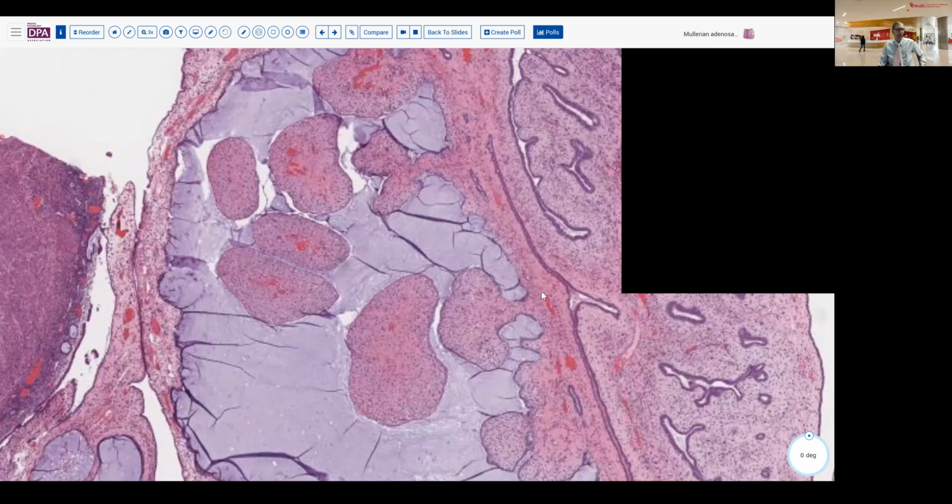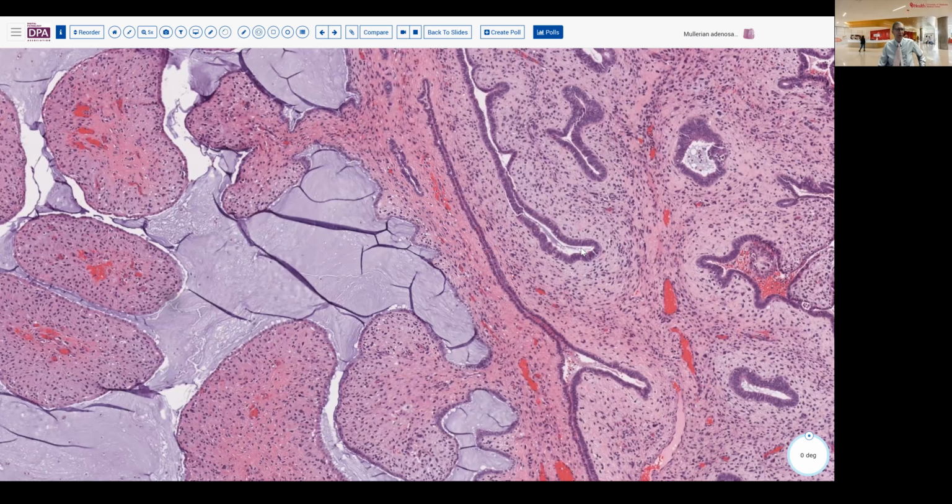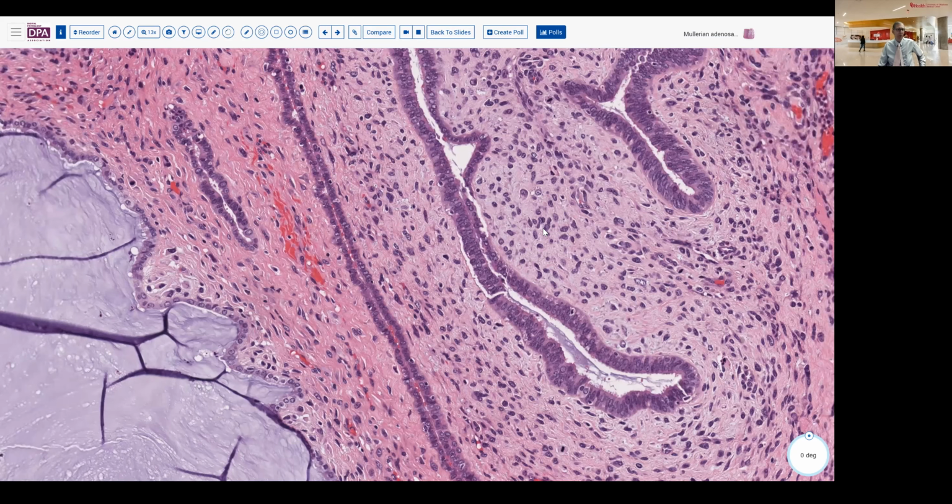And again, the cellularity in this particular area in the stroma is not high. This would be a low-grade area with just very low-grade appearing sarcomatous elements, not normal endometrial stroma. And you would find mitoses and some degree of atypia in this, but with a benign appearing epithelial component.